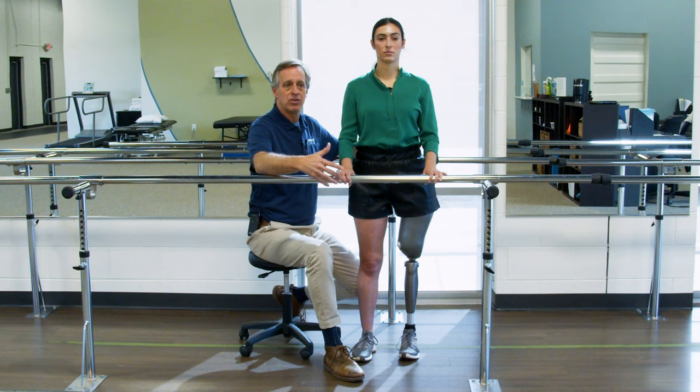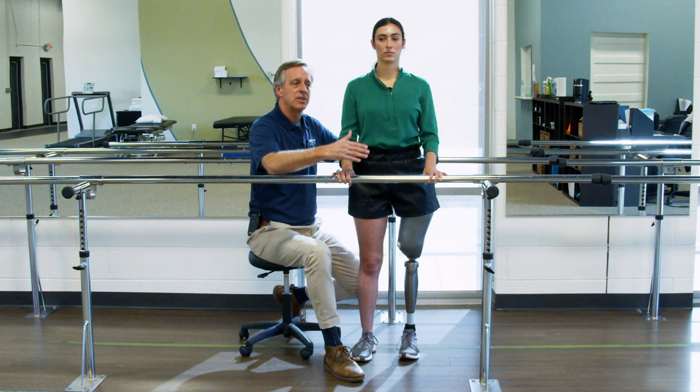So again, you can do some of these drills I'm showing you here very simply, like at the kitchen counter. You can lean on the counter at home and go up and down the counter for support. You can do these in a hallway where you can put your hands on the wall of the hallway. But someplace where you can hold on and get moving a little bit and get the sense of lateral movement.